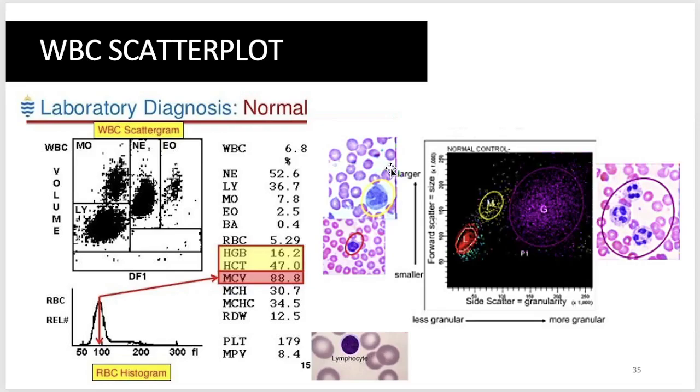Usually kasi may mga iba sigurong doctors na they don't prefer this data, gusto nila makita talaga yung diagram like this. Pero ako personally, automatically dito ako sa data. Okay, like, ako namang interpret 6.8. That's normal. I don't want to, kasi hindi ako marunong dati. Technically speaking, because of this lecture, doon ko pa naaaral yung mga RBC histogram and your granularity. I'm also learning. So, learning is fun.